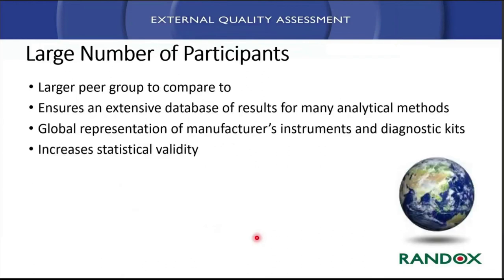Large number of participants, as I mentioned, ensures an extensive database of results for analytical methods. It's a global representation of manufacturers, instruments, and diagnostic kits. Why is that important? Well, if you're part of a small country, then you will obviously have less of those specific instruments that you're using in your country, as you would see globally. So we'd look at both.